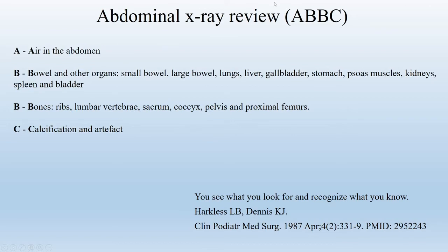So the mnemonic ABBC includes the following: A as air in the abdomen, B for bowel and other organs, another B for bones, and C for calcification and artefact.